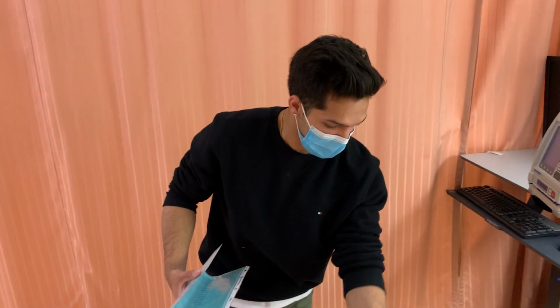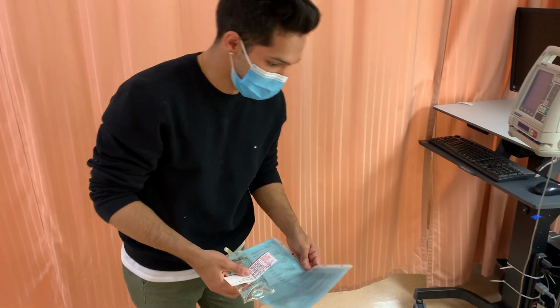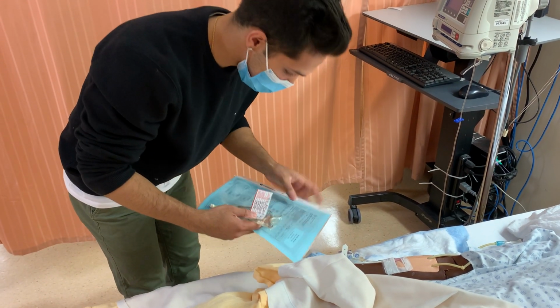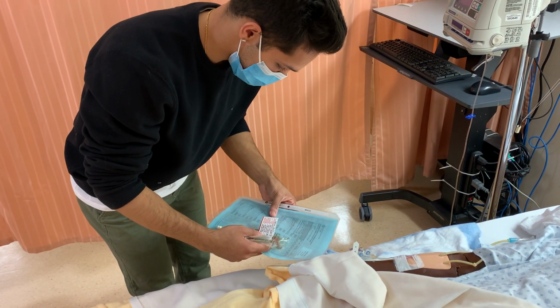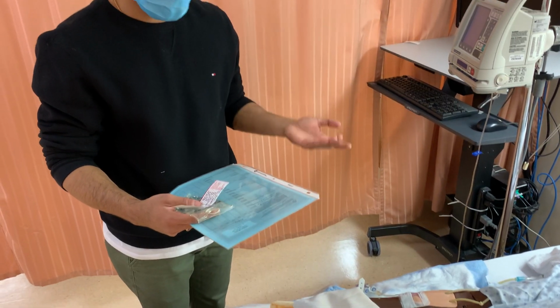Now, Mr. Scotland, I'm just going to be using your wristband to do my third check alongside my MAR. So this is for Bryson Scotland. The medication we have is insulin regular. This is insulin regular, and this is also insulin regular. The dose for this medication is 2 units per hour as per the continuous infusion orders.